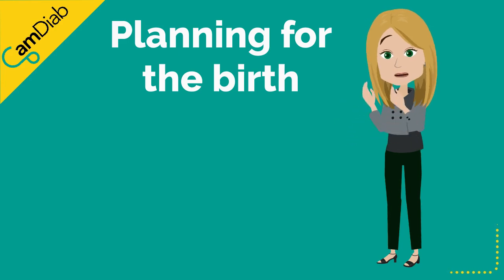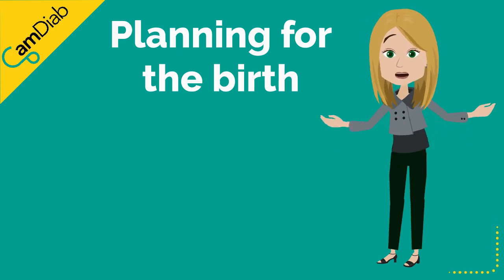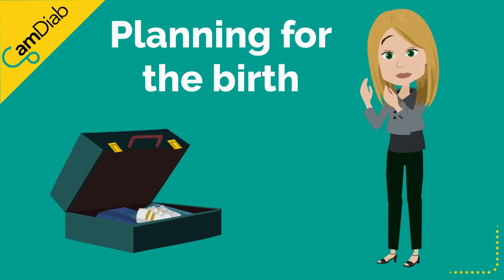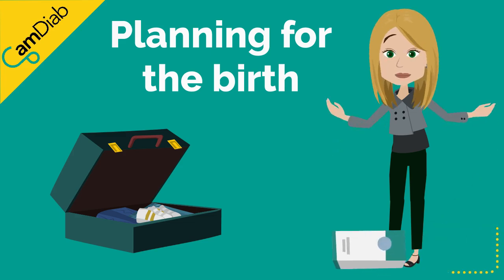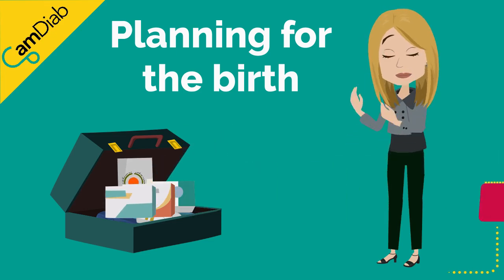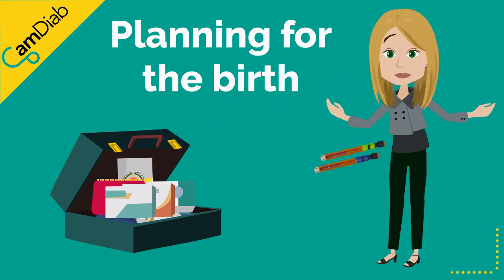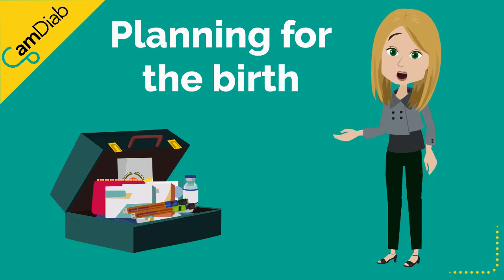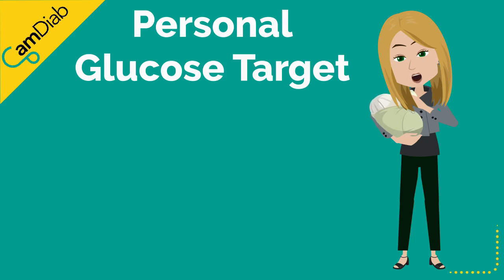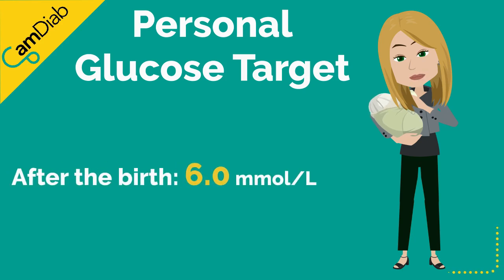Towards the end of pregnancy, it is good to plan the setting changes that need to be made immediately before or after the birth. Don't forget to pack your hospital bag with plenty of spare infusion sets, reservoirs, cannulas, sensors, blood glucose meter and testing strips as well as insulin pens and vials. The personal glucose target needs to be increased to at least 6 millimoles per liter across the 24 hours of the day just before or after the birth.